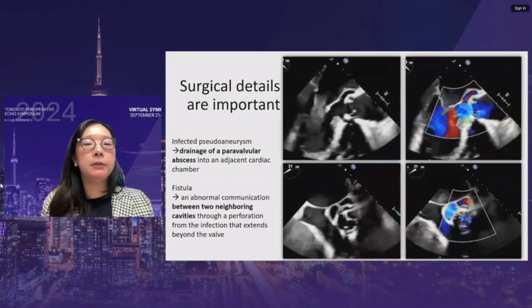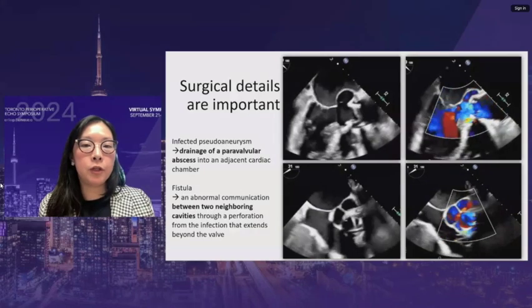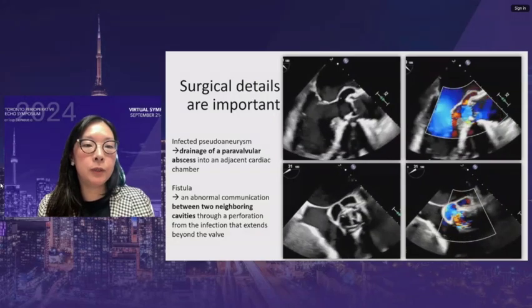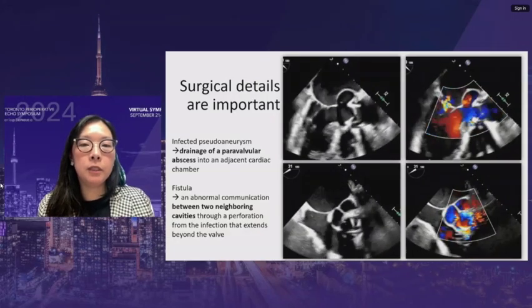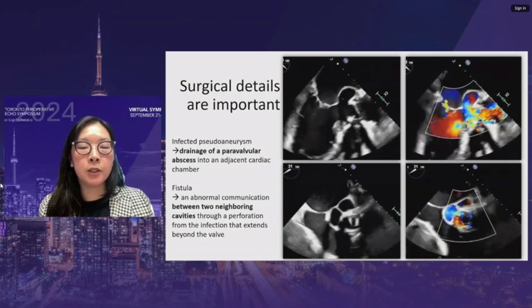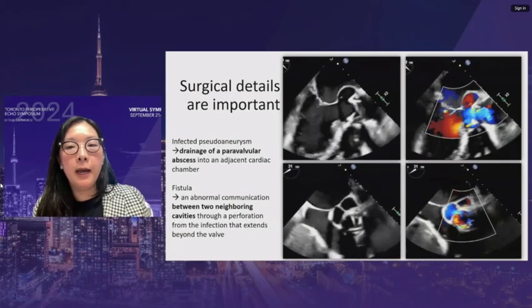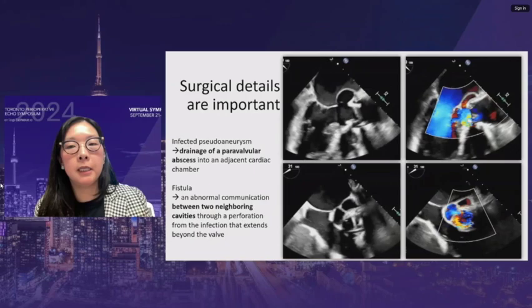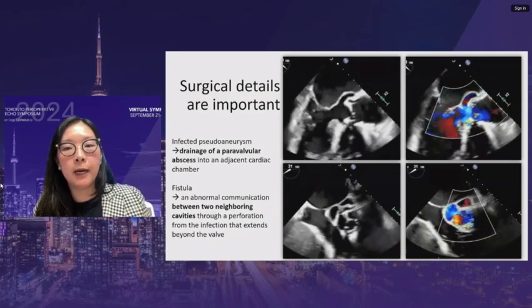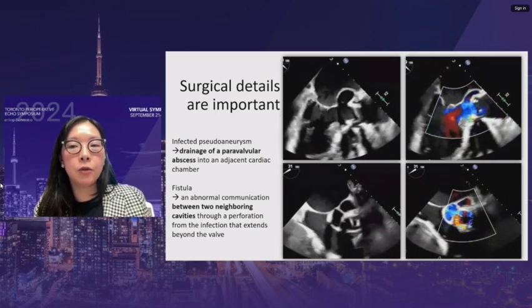Surgical details are critical. A patient with IE who had root reconstruction with valve replacement requires understanding of the post-surgical anatomy. Posteriorly, a large space is visible — a pseudoaneurysm, which is drainage of a paravalvular abscess into the adjacent cardiac chamber. At approximately 6 o'clock, a jet is seen representing a fistula — an abnormal communication between two neighboring cavities. In this case, it is an aorta-to-LV communication through a paravalvular leak.